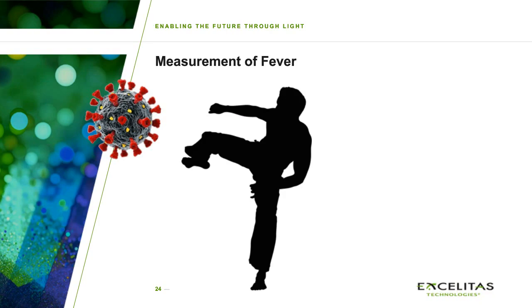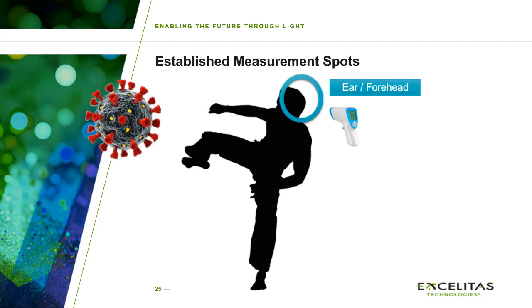How can we measure the fever? Fever is mostly measured with 2 different approaches on the head, where you can look into the ear canal, or on the forehead, or you can have the rectal measurement with a probe.